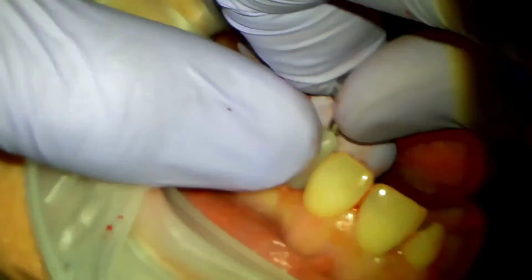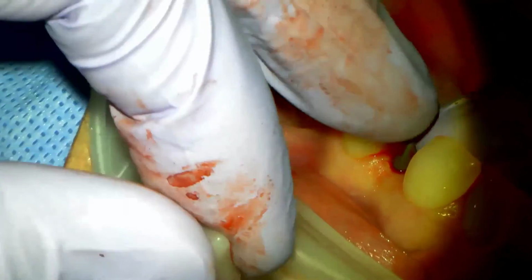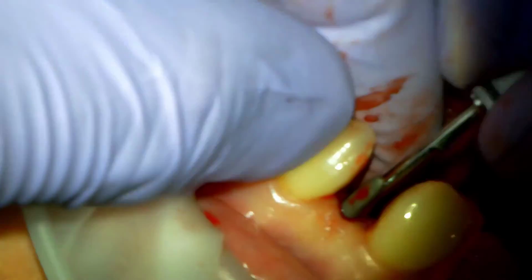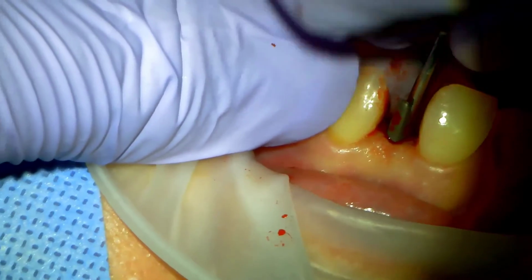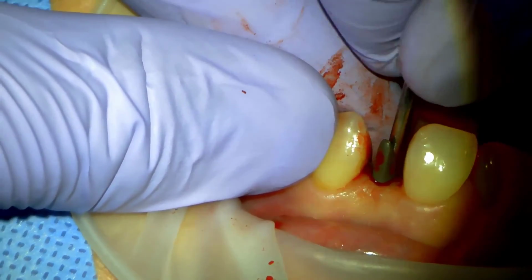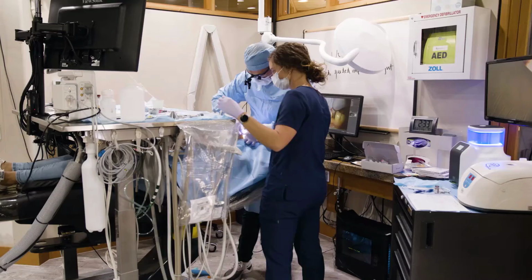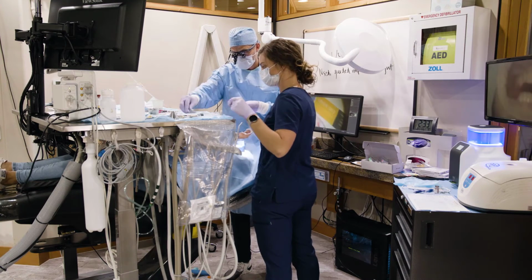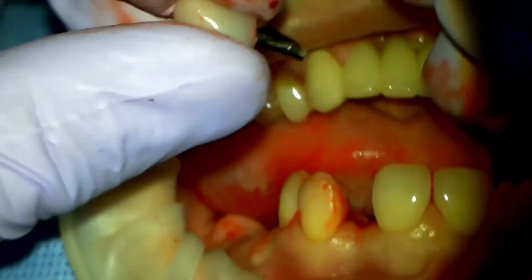Does this even... Seems to be seating decently there. You're seeing the custom abutment in place. To me, it does not seem like it's rotated the exact way. See how it's rotating a little on me there? Let's take that crown again. So let's try this one more time.